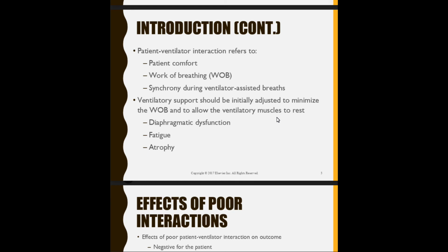So when we talk about patient-ventilator interaction, we're talking about patient comfort. We want them to have a decreased work of breathing. We want them to be comfortable. Synchrony during ventilator-assisted breaths. We want to make sure that they, meaning the patient and the ventilator, are breathing as one.